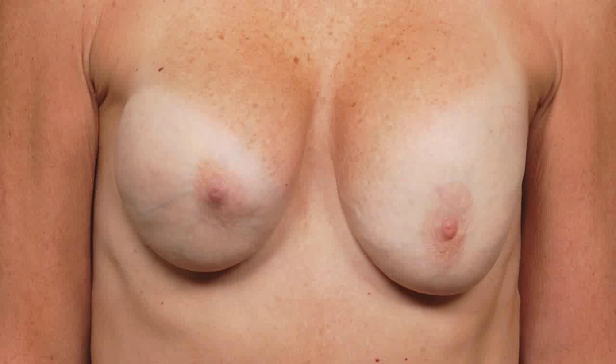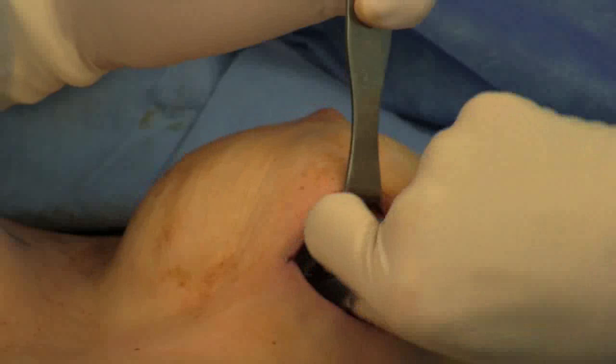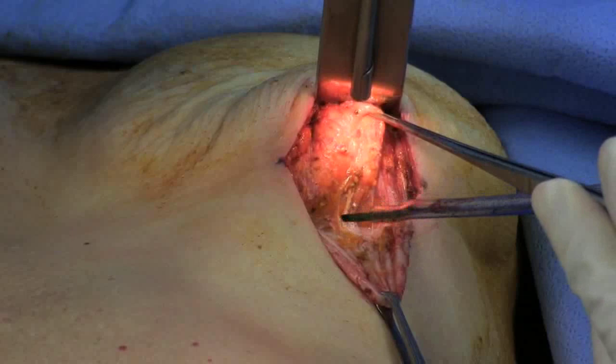This patient has had multiple breast implant procedures with repeated episodes of capsular contracture. Here the capsule is incised and the implant removed. The capsule is then separated from the surrounding breast tissue and removed.